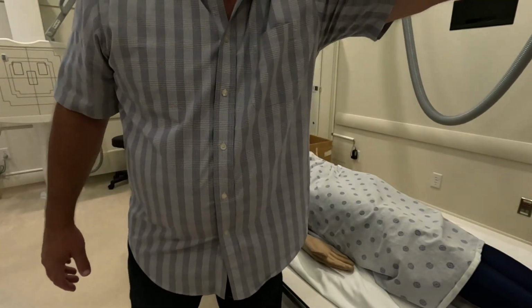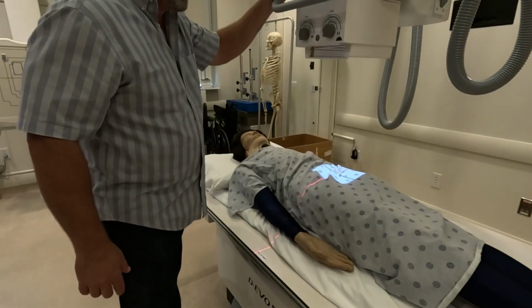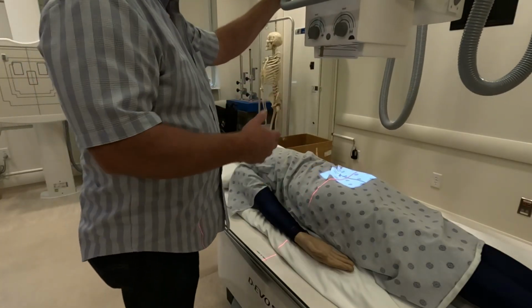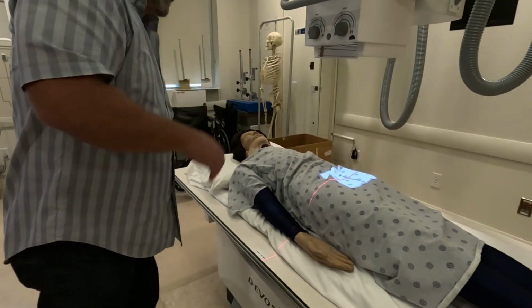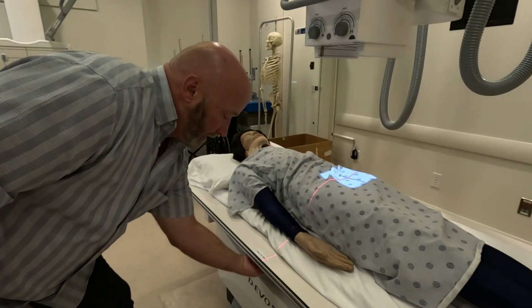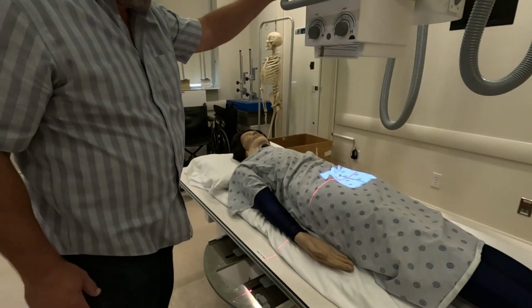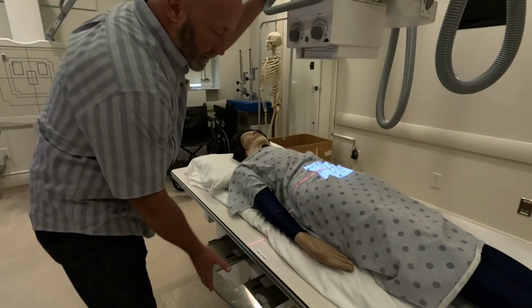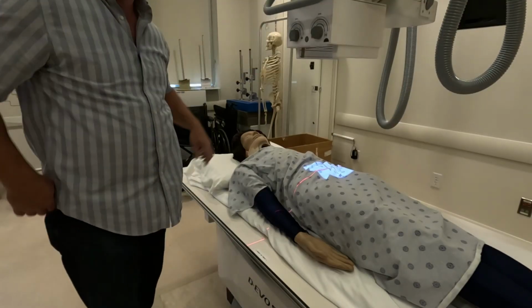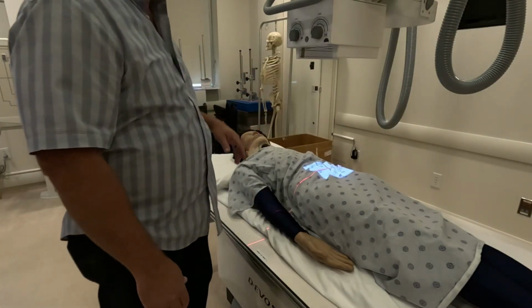So the next thing you're going to do is move the X-ray tube into a position that is close to where you want to shoot the X-ray. So you get the X-ray tube up there. And the next thing would be to make sure that your X-ray tube and your image receptor are aligned. And there they are.